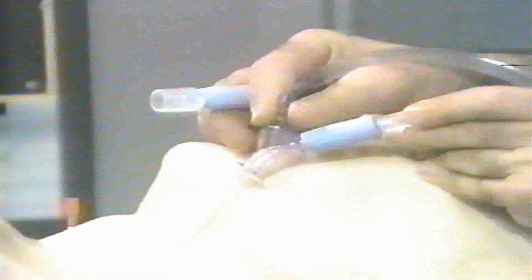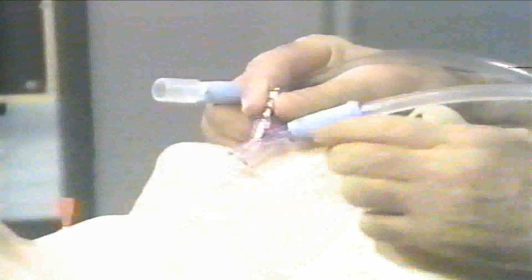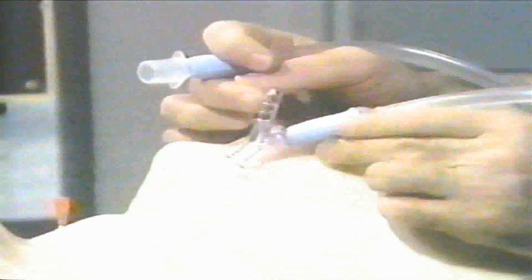While other measures or other treatments are done. If high frequency jet ventilation is not available in your hospital, a hand jet ventilation can be done by this method. Although there are some manufacturers that have made one, this can be made by yourself at your own place. A 2 cc syringe is attached to this Y connector.